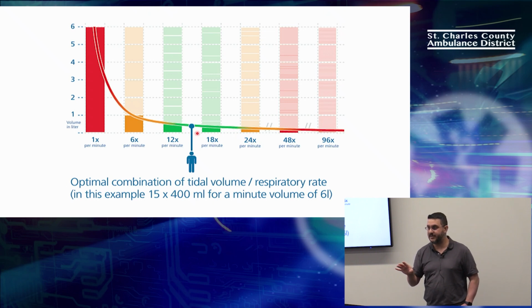I see blank faces right now. I'm just curious because the way it was explained was based off of the lung compliance. So it was going to give as much volume as it can when it reaches that lung compliance. Then it says, hey, this is the volume. We're going to start showing the rate. It does that, but it depends also on the patient's effort too. So your compliance changes. The machine does not have an inspiratory pause. It does not have a valve that can shut it off and tell it the actual compliance. So it figures out your compliance based on some math. Yeah, so it figures out your compliance based on pressures.